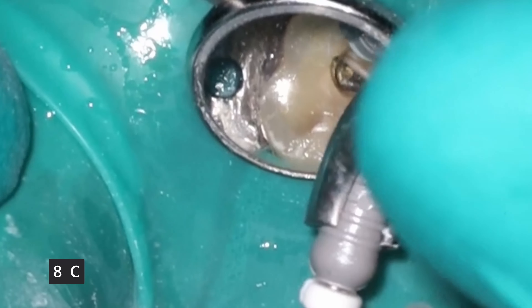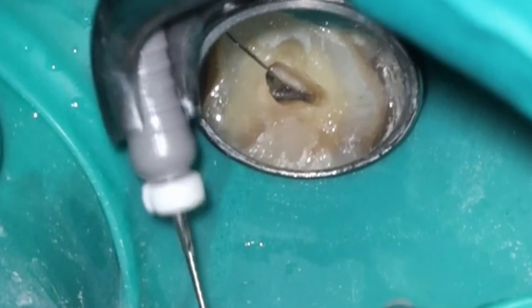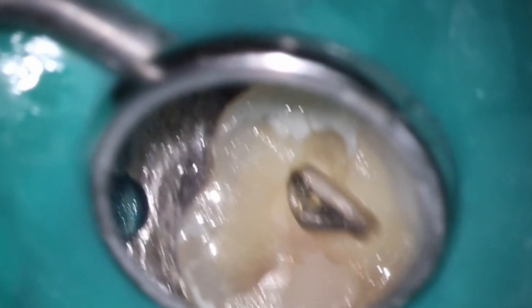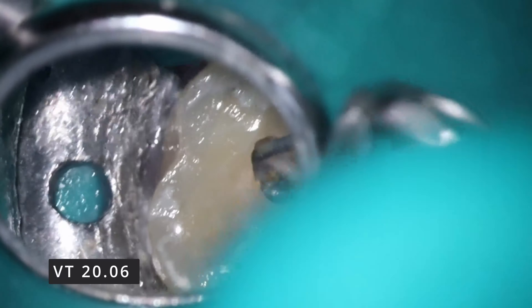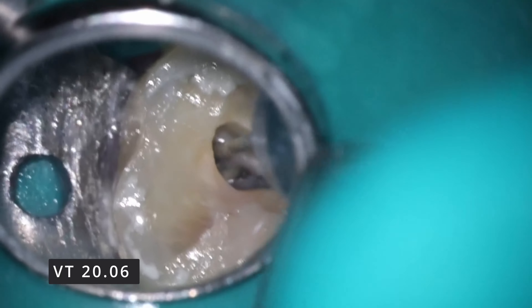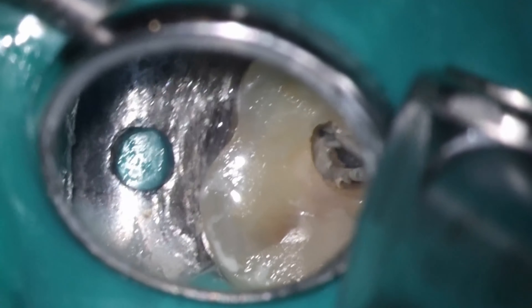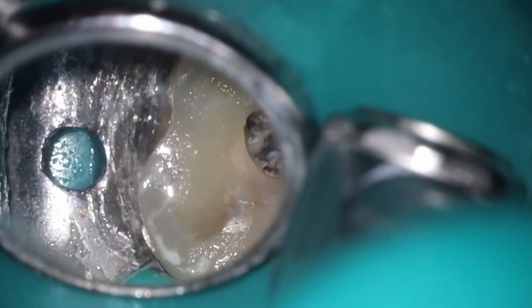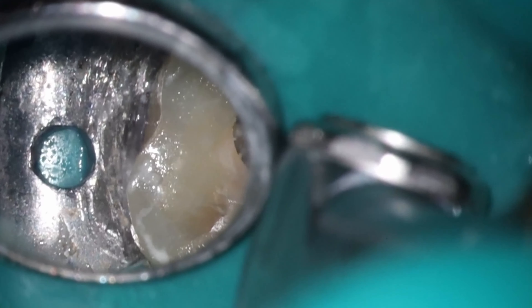So let's talk about the hand filing process. I got the AC going to get that cleaned out, dropped it down about halfway. I got MB, I got MB2 — not really a distal buccal, looked good — and palatal was a no go. So that was my hand filing. That's all that I do for hand filing on the vast, vast majority of cases. I will find one where I actually need to use multiple hand files, but that's it.